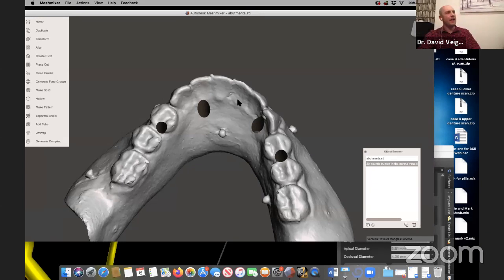But then I guess you have to also consider this. The implant, if the shrinkage is going to occur, does it really matter at this stage? Because the implants aren't integrated yet. So the shrinkage is going to occur, it's going to pull on your implants, and then it's going to relax because your implants actually haven't bonded to the bone. So as the acrylic has relaxed, the integration of the implants is going to occur over the next 3 months. So the shrinkage at this stage doesn't actually matter.